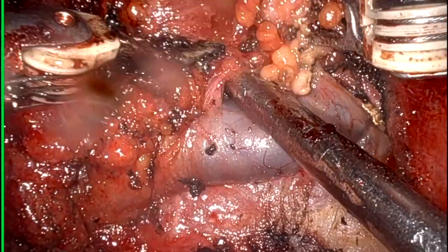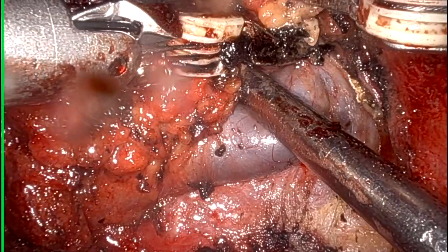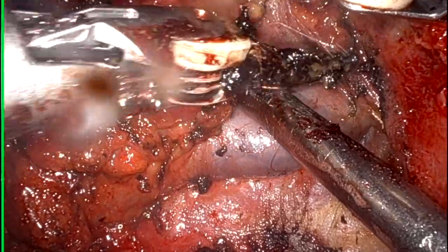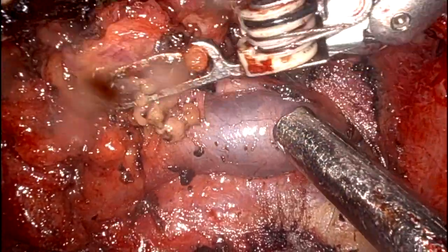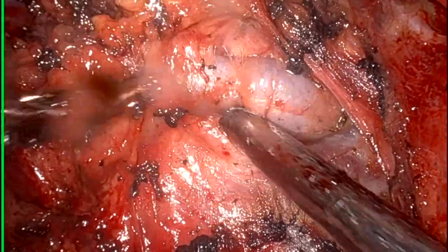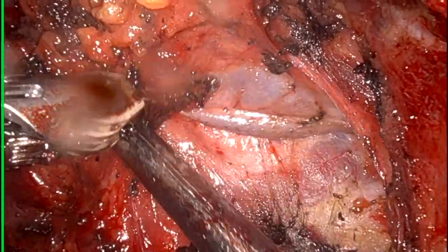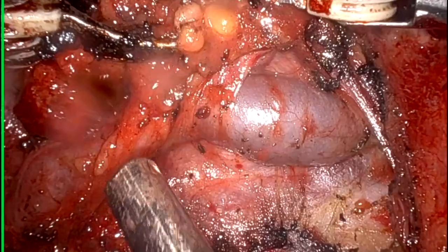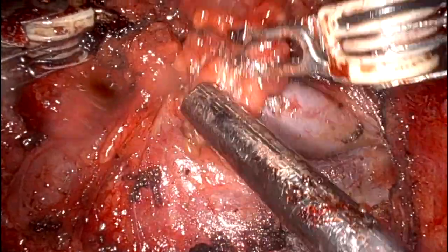I'm sure now you're clear that the basic philosophy of neck dissection is the same, whether you do it open or you do it with robotic system. In robotic surgery, we have just changed the incision, we have just changed the instruments, and we have just modified our approach a little bit. But basic philosophy is the same.